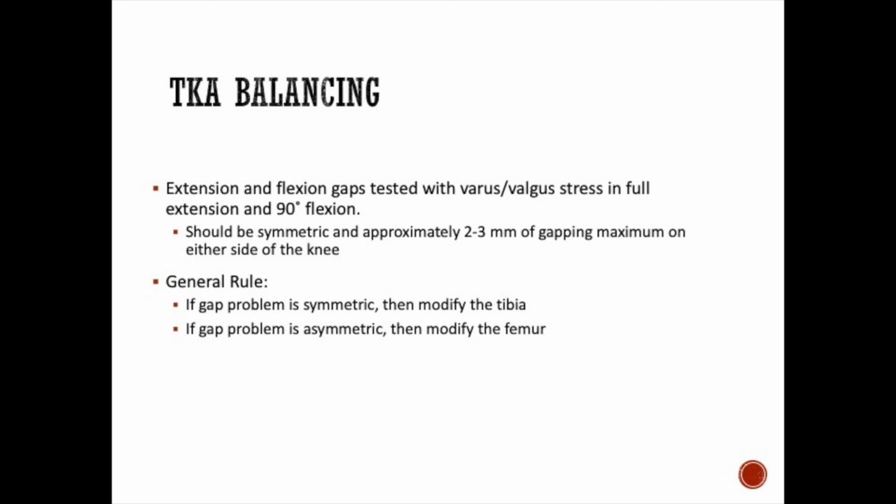Now that you're through the knee replacement itself, now you've got the implants in, ideally during trialing of the implantation, that's when you check your balancing. Balancing is the art of knee replacement surgery. That's where you try and make sure that in flexion and extension, the ligaments are tightened equally. You also want to make sure that there's not over-tightening, and that it's balanced in terms of how much small amount of laxity there is medially or laterally in varus and valgus stress.